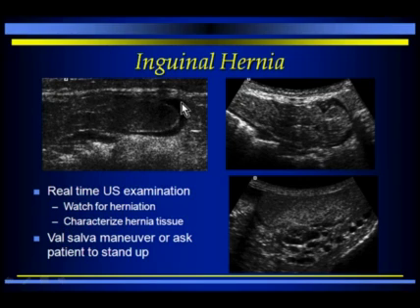So here we see a small amount of fluid, and we see mesenteric fat herniating down. Once again, this is a piece of omentum herniating down into the inguinal ligament.